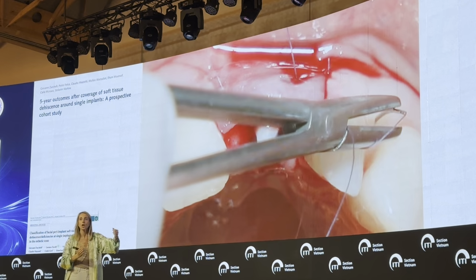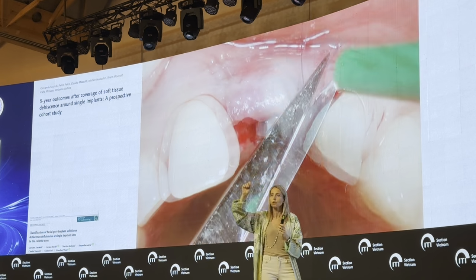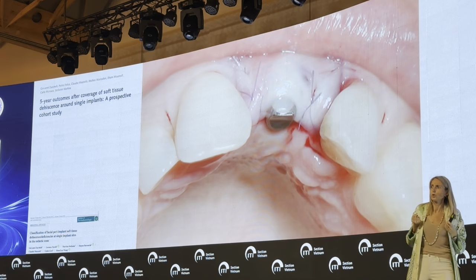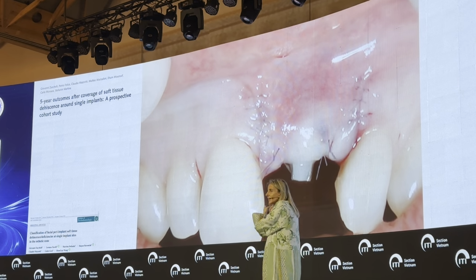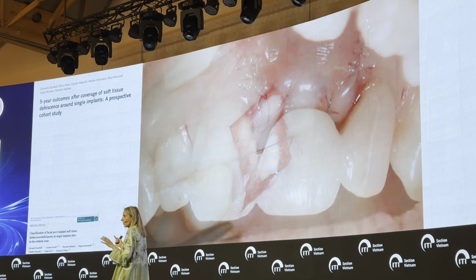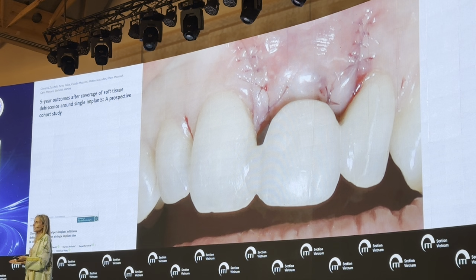With the tunnel technique, you always struggle in trying to maintain the tunnel in a coronal position, anchoring with the suture, with the composite pin, your flap, which is going to be forced to stay in a coronal position. While here, the flap is already stable in the coronal position without the sling suture, because it's completely passive, without any tension. You saw the superficial split thickness incision that was performed, maintaining the blade parallel to the inner aspect of the alveolar mucosa, removing all the muscle insertion.